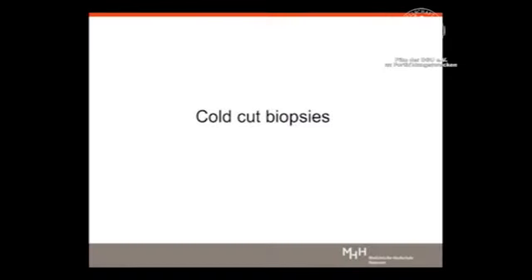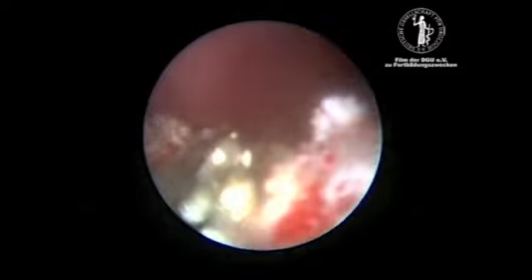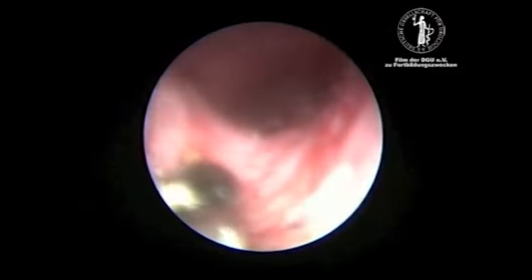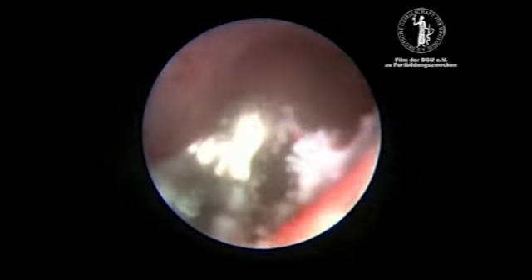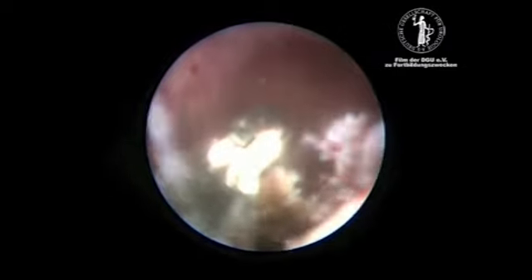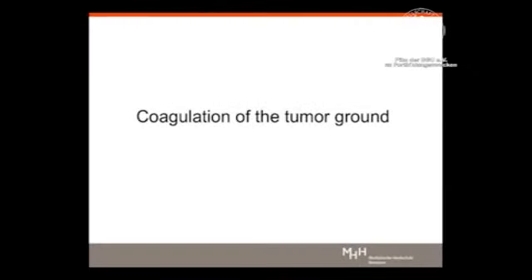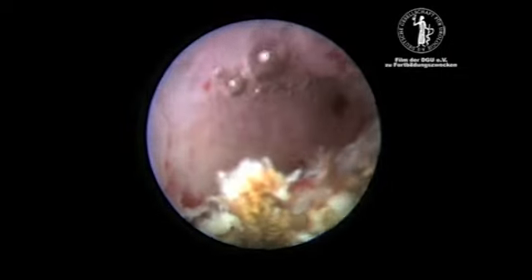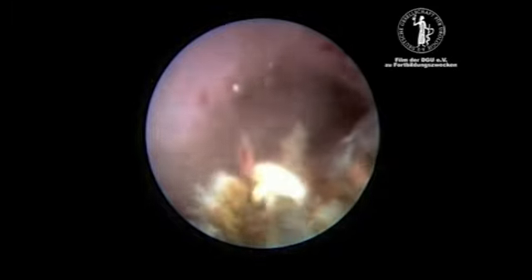Cold cut biopsies from the tumor ground. Coagulation of the tumor ground. Finally, the tumor ground is coagulated with laser energy.